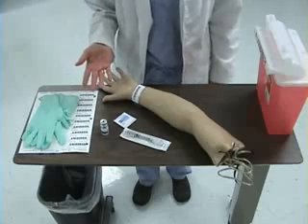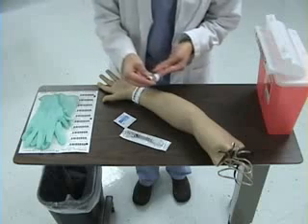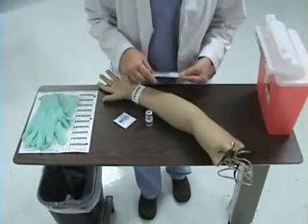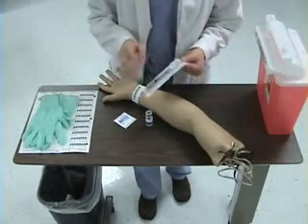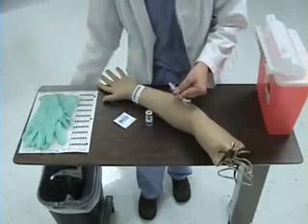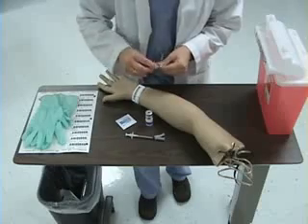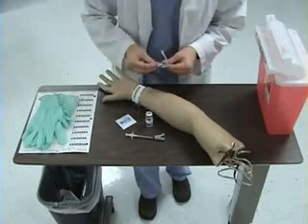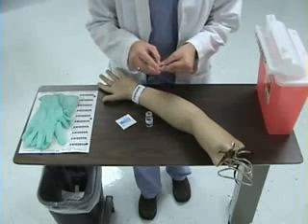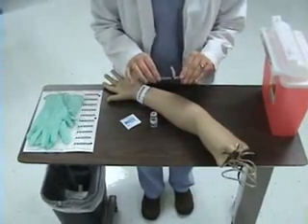Next, I will prepare my injection. I'm examining my PPD vial and checking the expiration date. I will open the wrapper of my tuberculin syringe. I will cleanse the rubber stopper of my PPD solution with an alcohol prep. The dose for PPD is always 0.1 mLs.